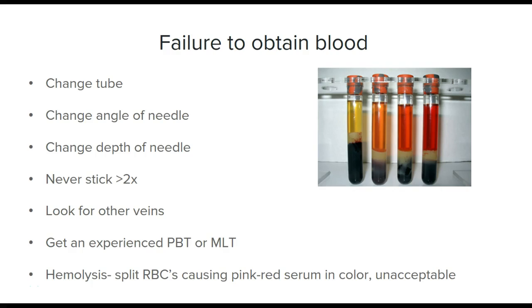If you have stuck the patient already, you can ask them, can you try again? But you never stick them more than twice. You go and get somebody else to stick them, preferably somebody that has more experience.